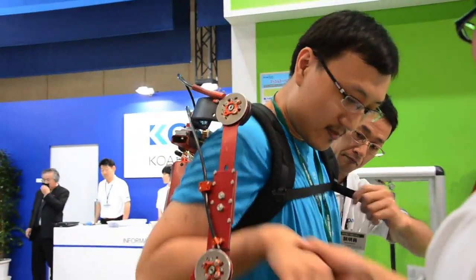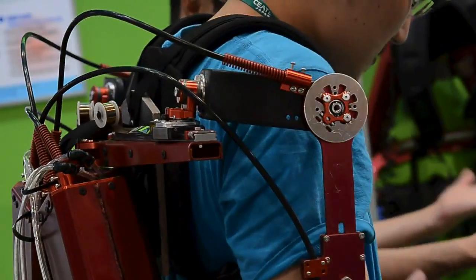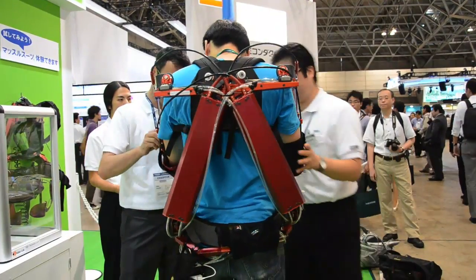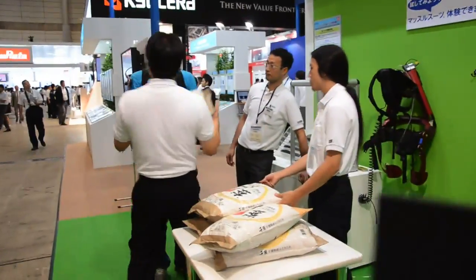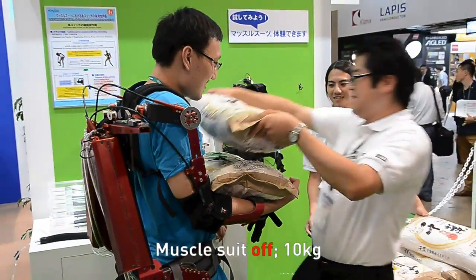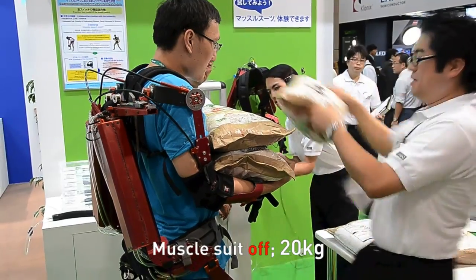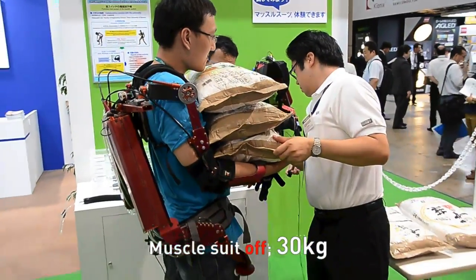This is actually some weight. It weighs 9 kilos — the suit itself is 9 kilos. 30 kilograms total being carried.